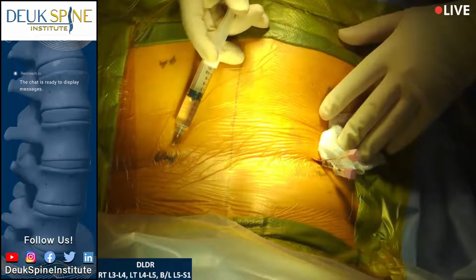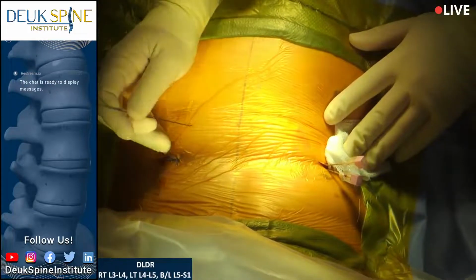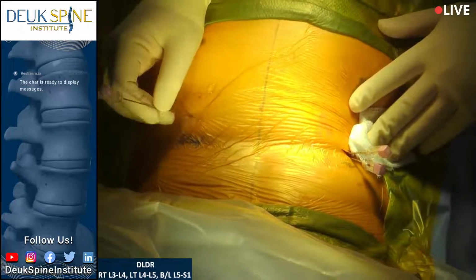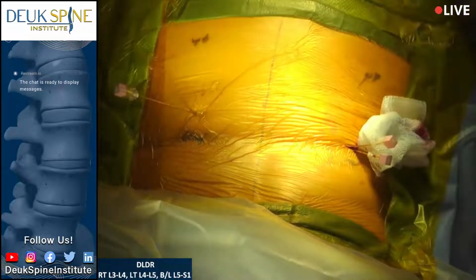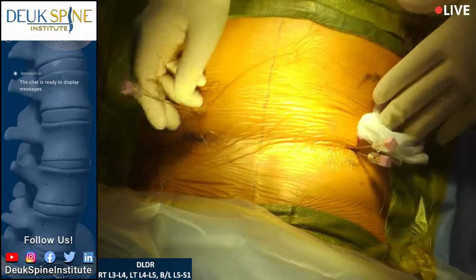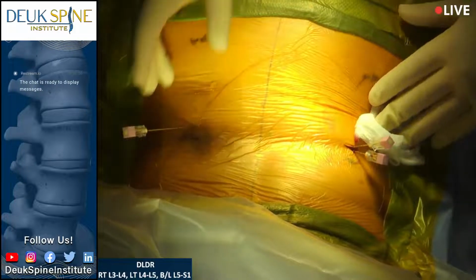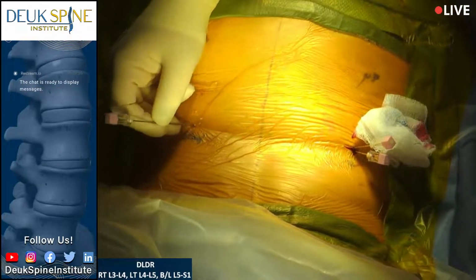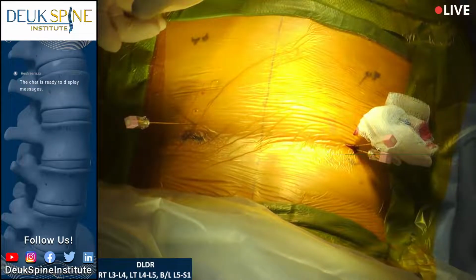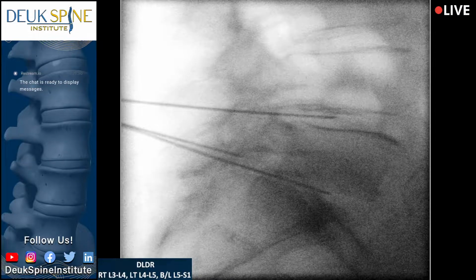So people always want to know, why do you have to be awake for the surgery? The reason is that I need to know that I'm not too close to any of the nerve roots. And the patients will always tell you when you're too close to a nerve root. Very reliable. All right, just relax. You're fine. One of the nice things about this particular surgery is that you don't do it under general anesthesia. We do it with local. So believe it or not, that's a lot safer for patients, because you don't have to give them general anesthesia, which is very stressful to the body. You're okay. You're doing great. Shot.